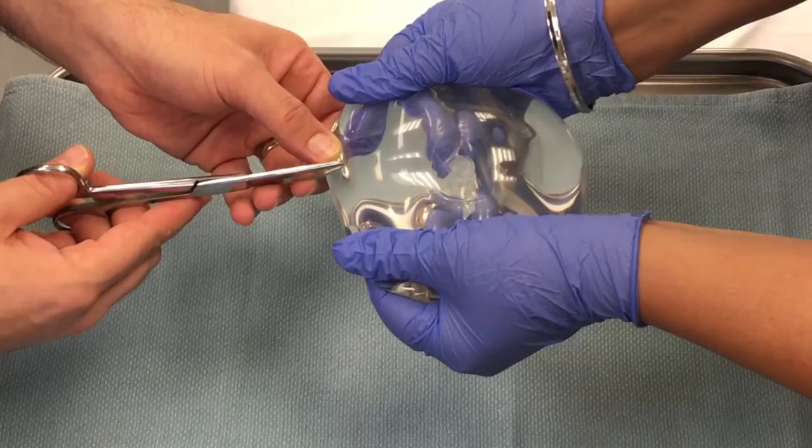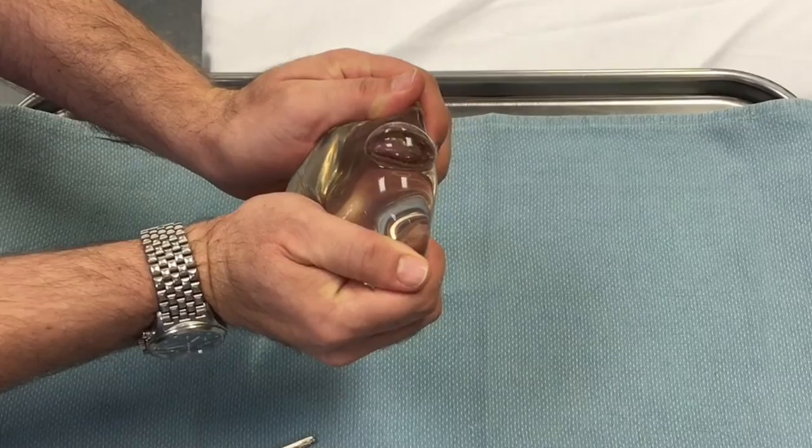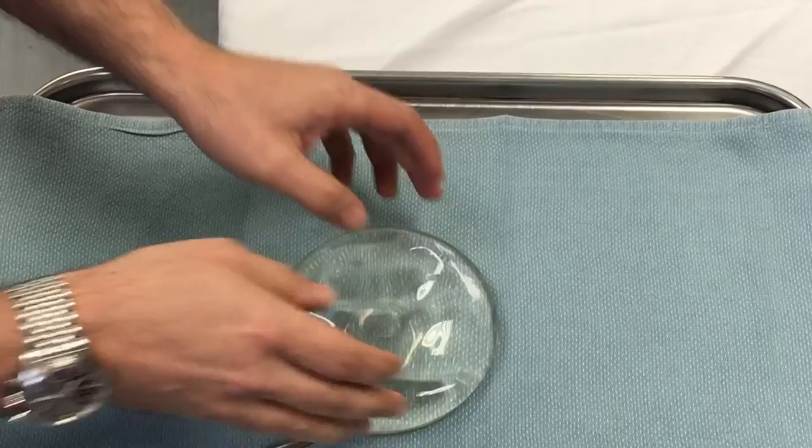With that small nick, you can see that when the implant is squeezed, the silicone bulges out — but in its native state, it stays nice and contained within the implant.